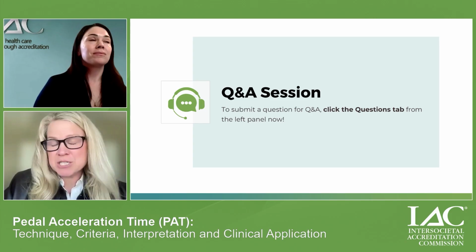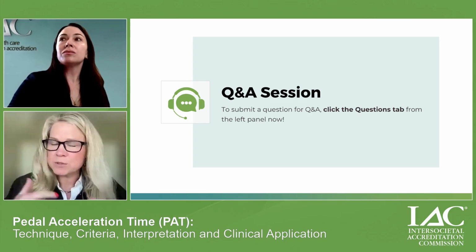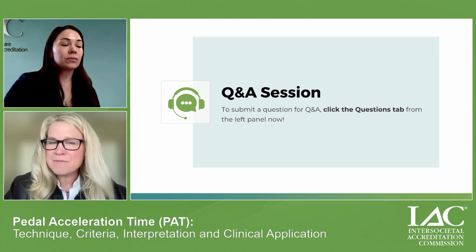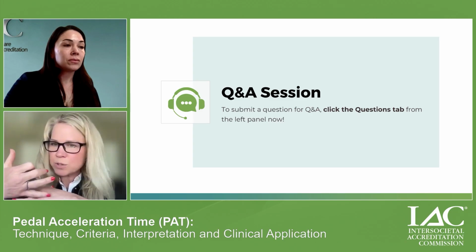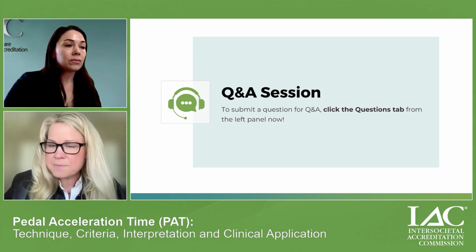Yeah, it's a great question. So 90% of the time, I use a standard linear probe that we use for carotid. I will use a hockey stick or high frequency probe if the foot is small or if I'm getting on this tiny little dorsal metatarsal artery. So like anything, just use the probe that's appropriate to the patient in front of you.